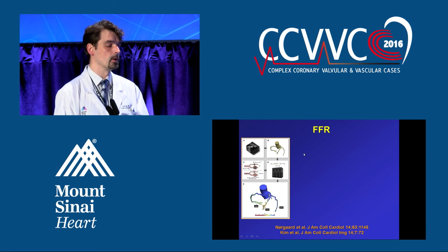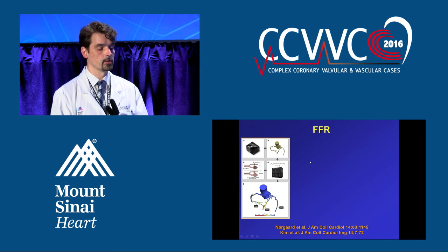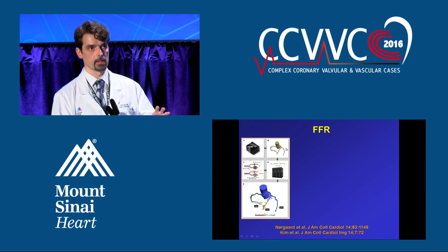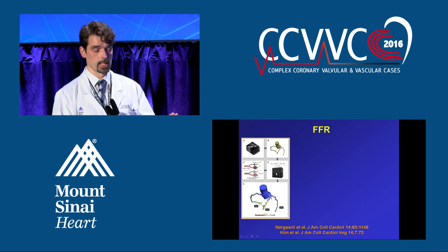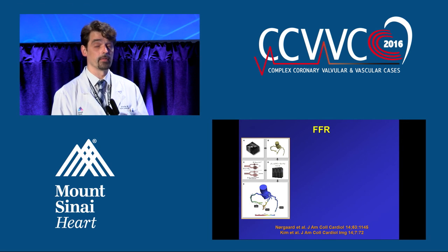And finally, I will conclude talking about FFR. There is a new approach which is trying to measure FFR non-invasively with CT. And the way it works is the following. We acquire the images. We create a 3D reconstruction of the patient's coronary arteries. So it's a patient-specific model. And then computational fluid dynamics is applied. This goes into a computer. The computer, don't ask me what it does, processes the images for a number of hours, and then spits out a number. It spits out a number of what the FFR would be.